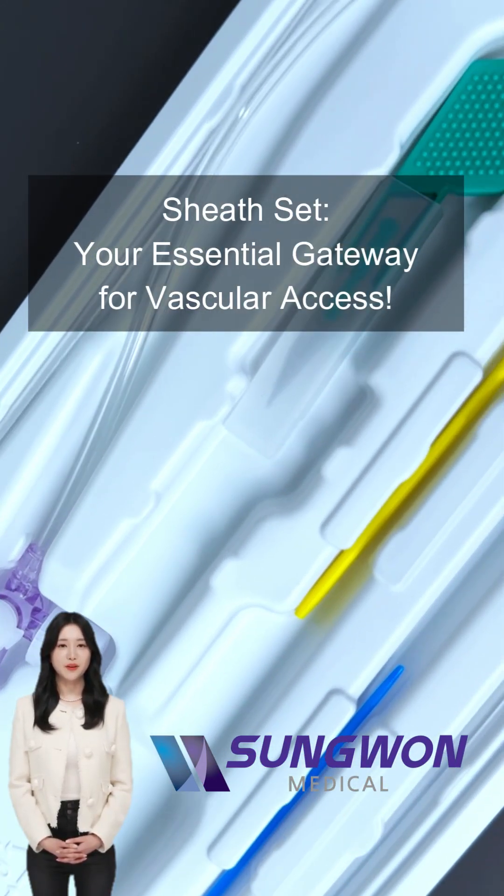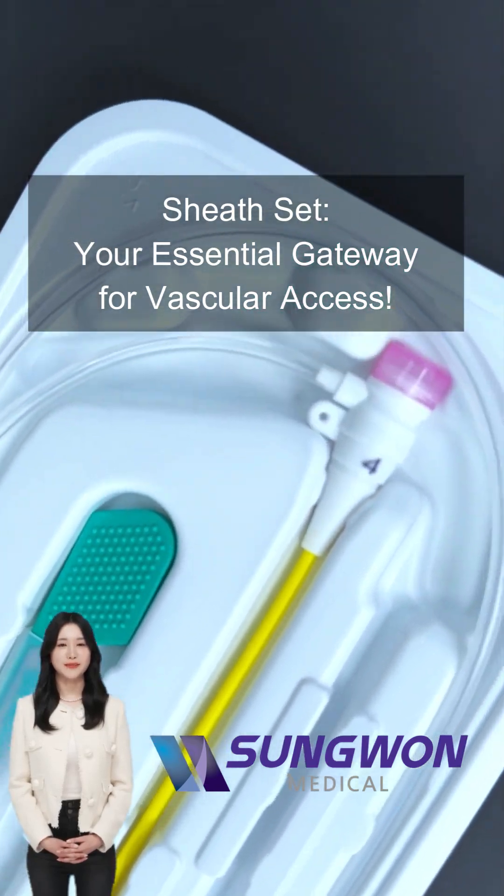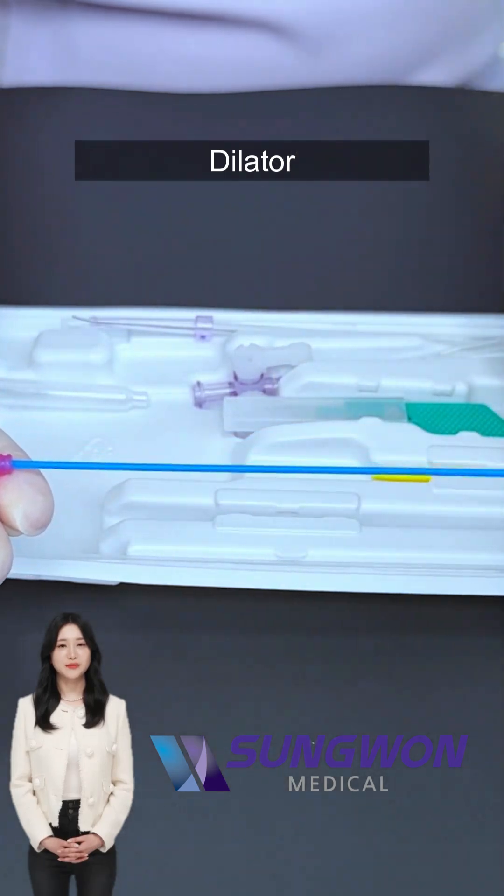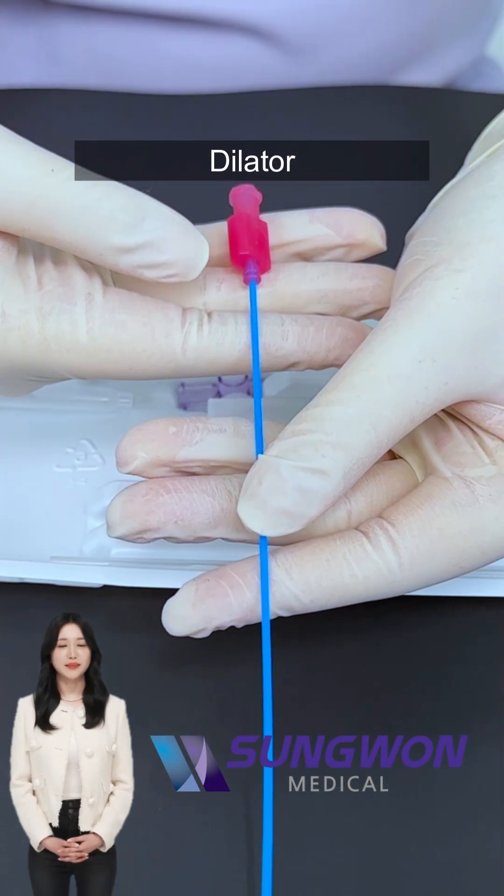A dilator is a slim, long plastic tube with a central opening. Once the needle is in place, you thread the dilator over a guide wire to gently widen the vessel tract.